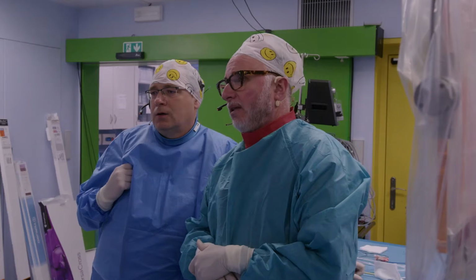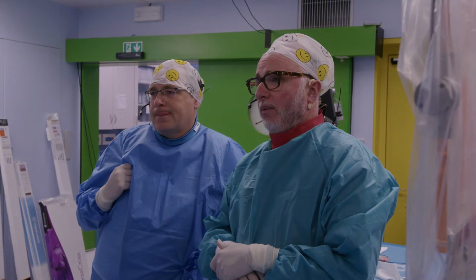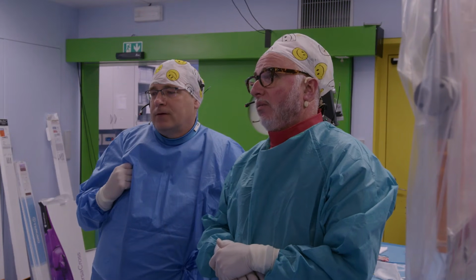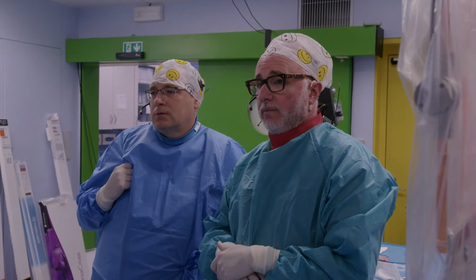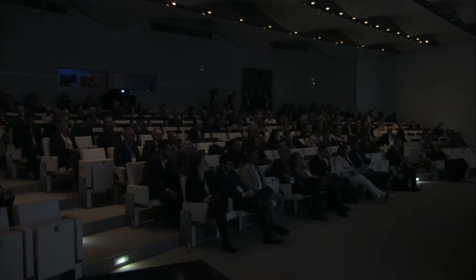Yeah, that was going to be the next step, but because the catheter was open, they wanted to try first with RF. But yeah, you're right. Going back and doing the same is not going to be a bad idea to finish the ablation in this region. I ask the audience, who would ablate here from the left coronary cusp above the left sinus of Valsalva? Because we've seen a couple of PVCs still there.